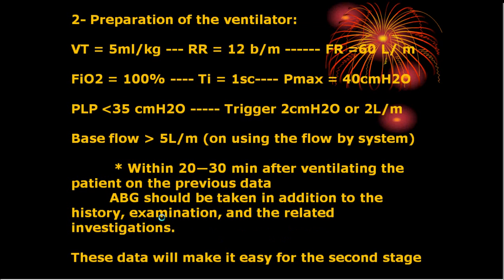The second part is to prepare the ventilator. So you give an order to the technician or to the therapist to prepare the ventilator. How to prepare the ventilator? This depends on the patient himself. Sometimes you know the provisional diagnosis, sometimes you do not know. So you will start preparing the ventilator empirically, and in this case you will give an order for the control variable and phase variable, and what type of ventilation it is, volume or pressure controlled ventilation.